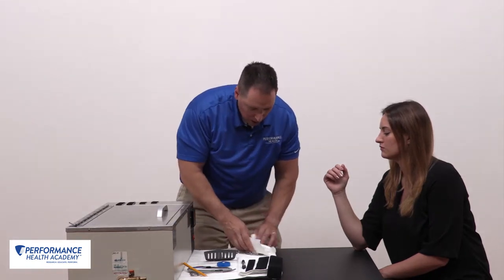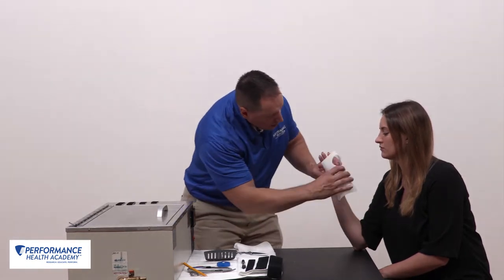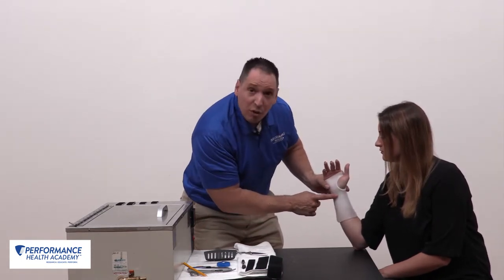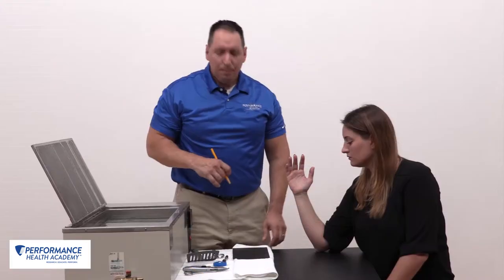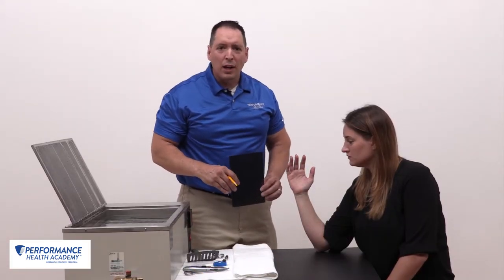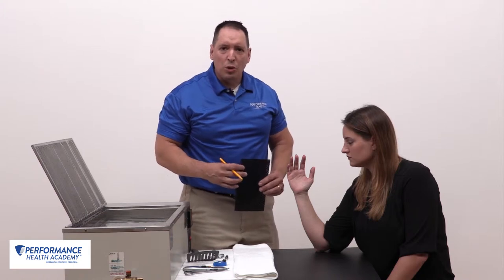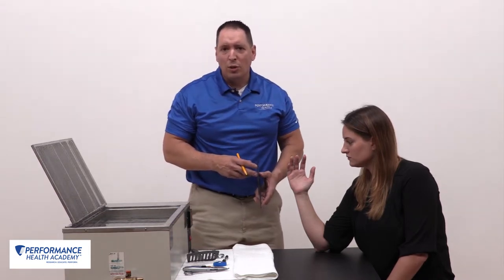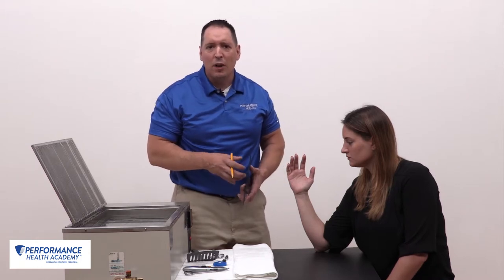After wiping down and reapplying, we're ready for strapping. This is another example of a custom fabricated circumferential orthosis I use in my clinic quite often. Our physicians and hand surgeons have found this to be very effective, and patients find it very comfortable.